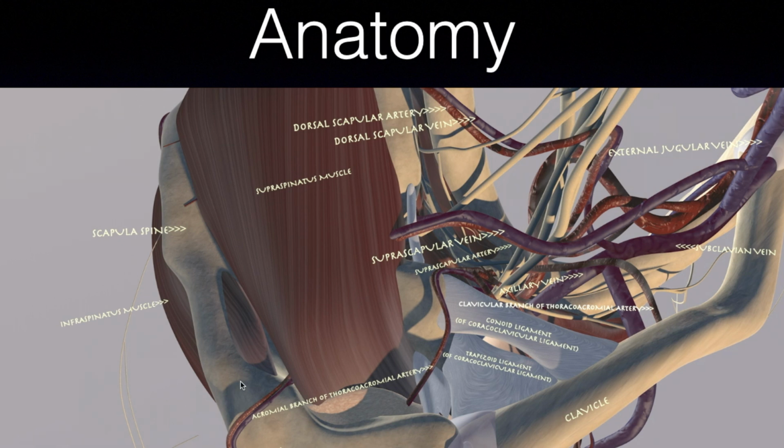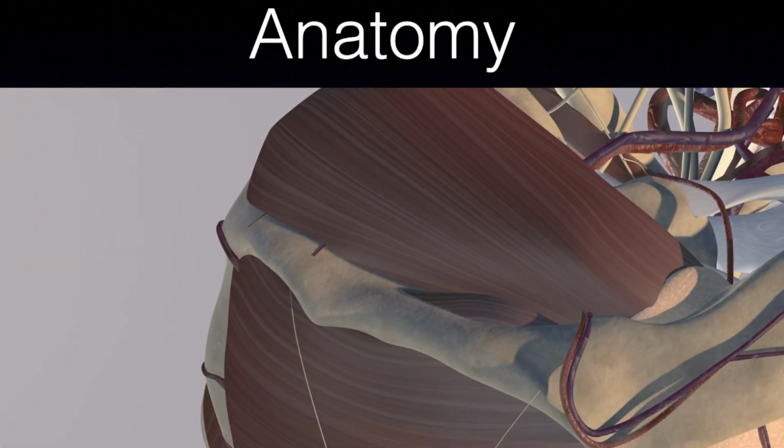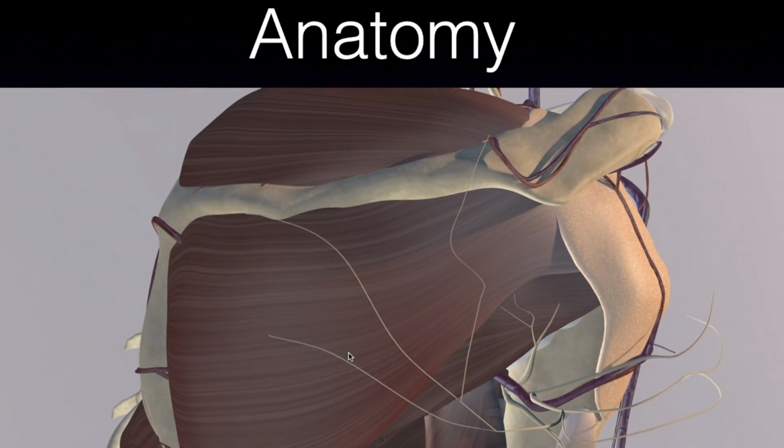And here's a bird's eye view. When people talk about impingement, I guess if you have an acromion where the supraspinatus tendon can rub under the acromion and get torn or tendinotic, this view helps you appreciate that. And then we're basically rotating posteriorly.